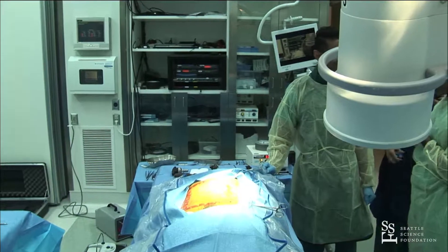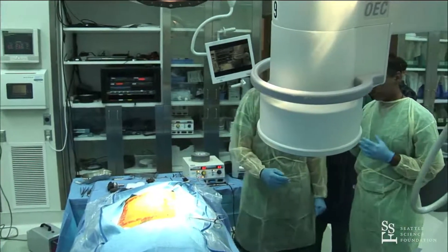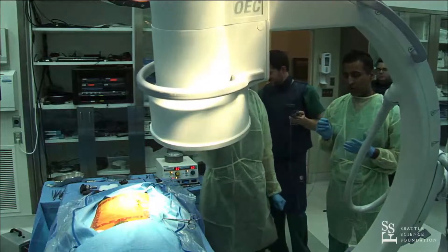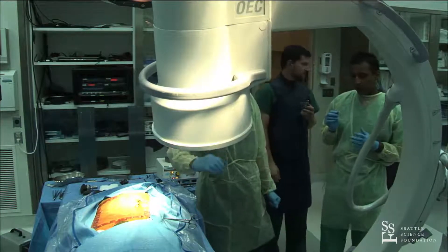I use neuromonitoring for 100% of my cases. It's the standard of care in New York to neuromonitor everybody.